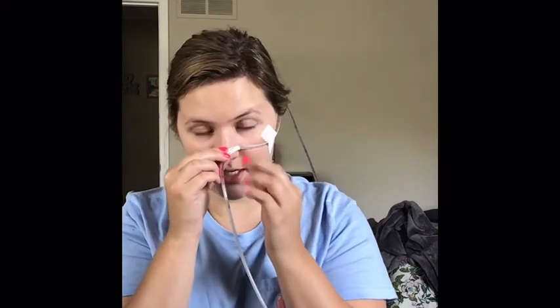So what I'm going to do, I'm just going to put this behind my ear really quick, and then I'm going to take a piece of my tape. Looks silly. It's probably going to hurt taking it off. Okay, so my tube is there. This is going to be really hard to show my tape.